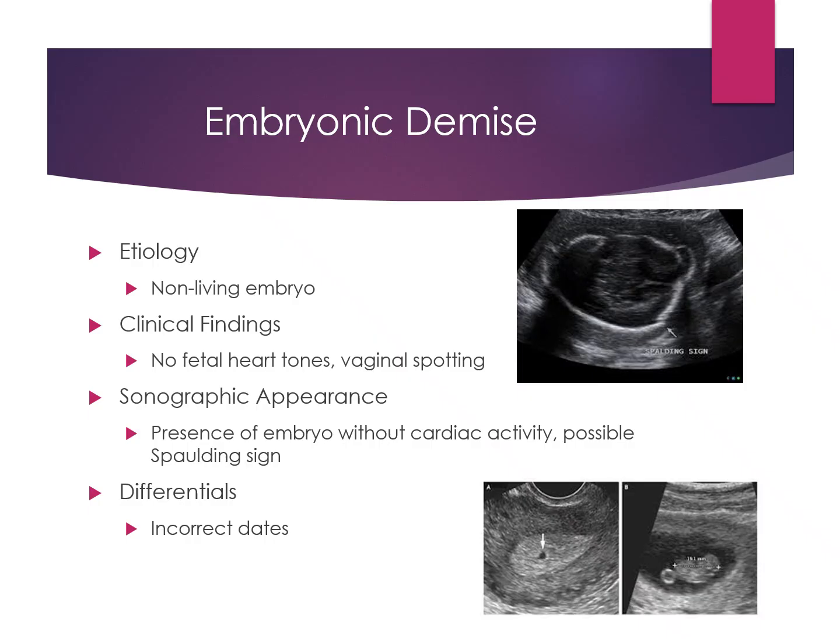So if you guys come with me, we have an embryo here, right? We have the uterus on the outside. We have no gestational sac. There's no fluid surrounding this baby in there. We have some brain tissue here, and then we have some calcifications, like, bone matter, right? But it doesn't look like the head. It is very wonky. We have some overlap of the skull structures.